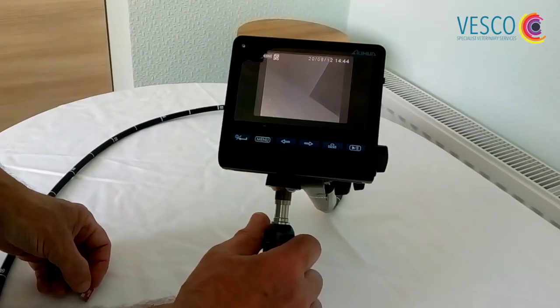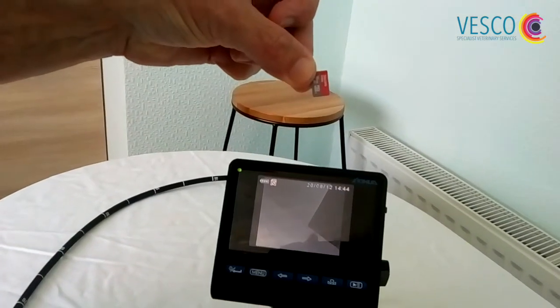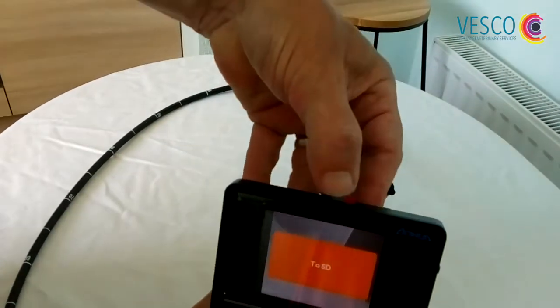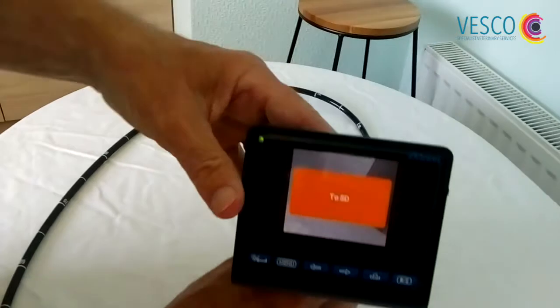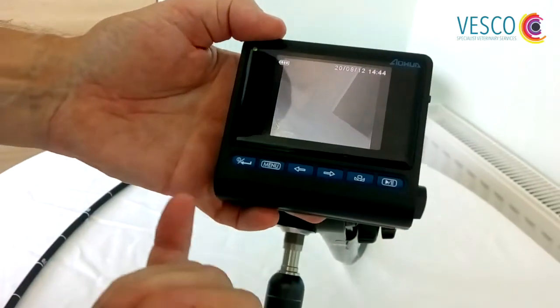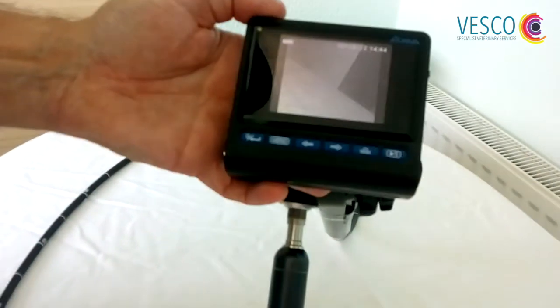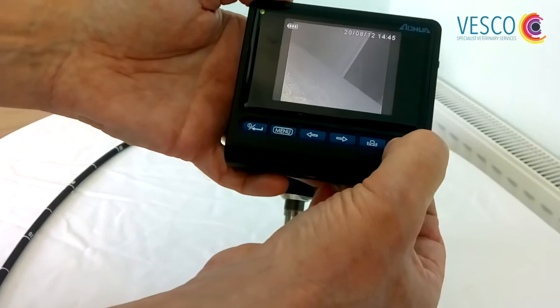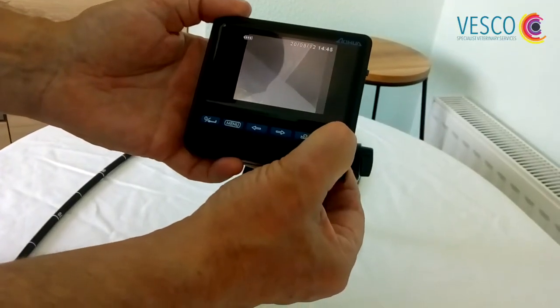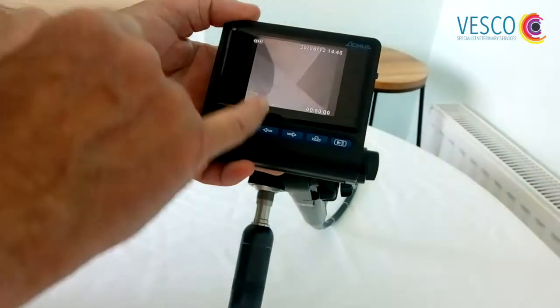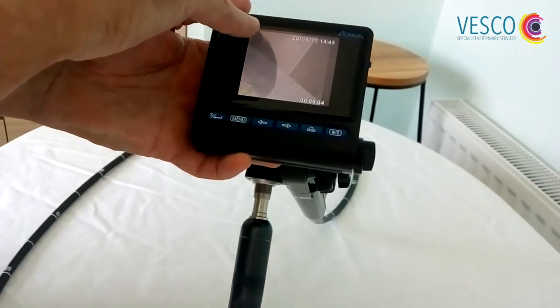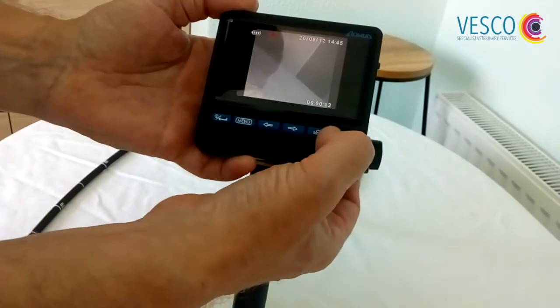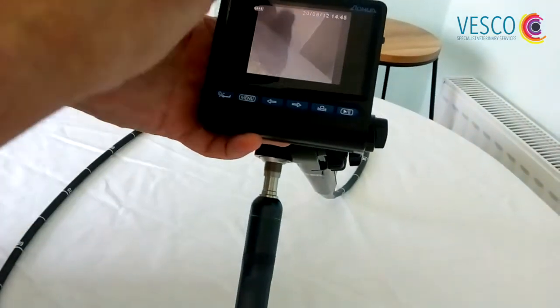In order to record images and videos, they're stored onto this little micro SD card which goes into this slot here. Press it down and make sure it engages. That says there SD, which means anything that I record or video now gets saved to that little micro SD card. To record anything at all, we simply press this button here. Just a quick press and as you can see in the corner up here, there is a red dot flashing and it's counting down the seconds, the length of time that you've recorded. To stop, quick press again. Screen goes clear and that's actually recorded that image now to the micro SD card.